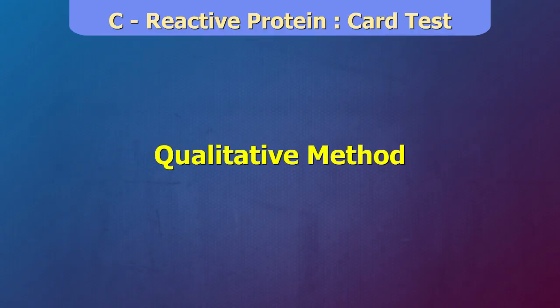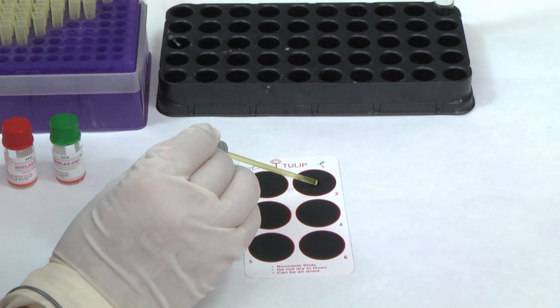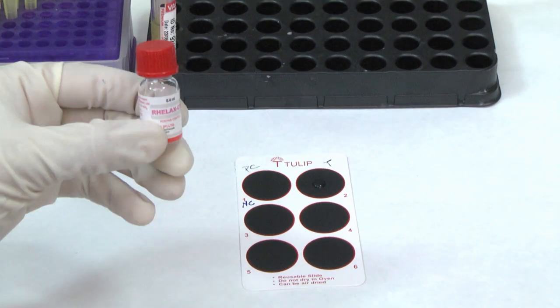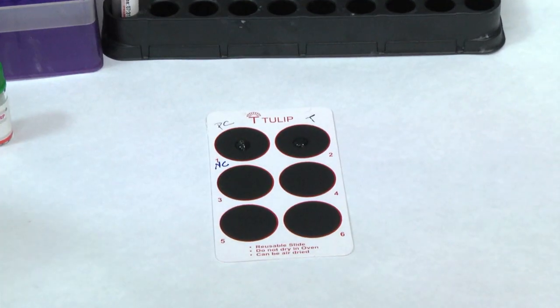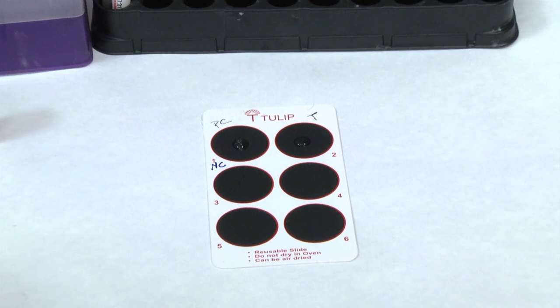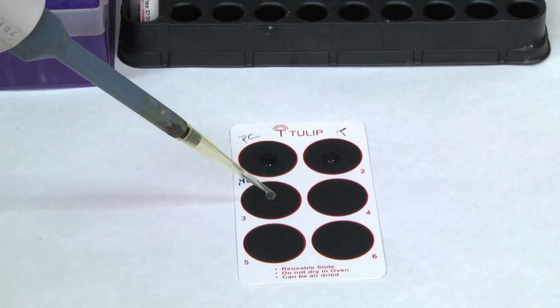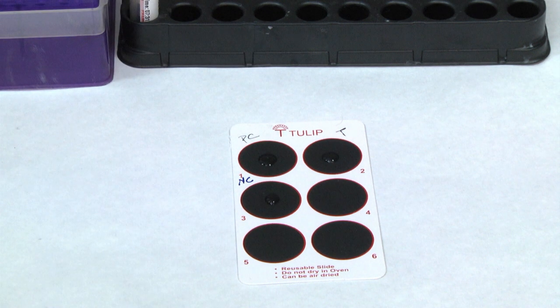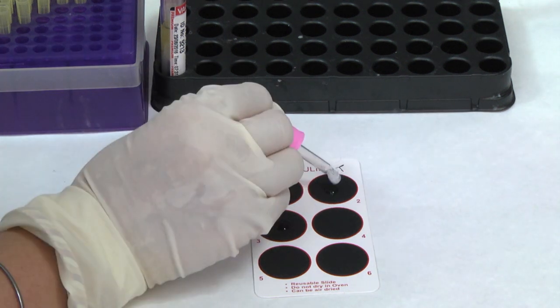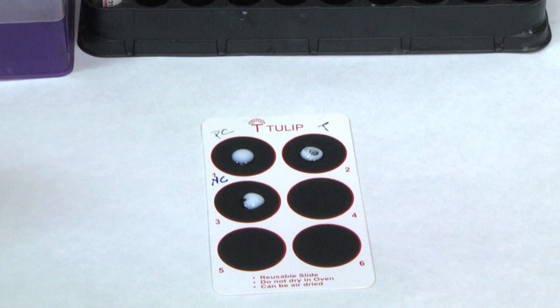Qualitative method: place 1 drop of undiluted test sample on field 2. Place 1 drop or approximately 40 microliters of CRP positive control on field 1 of the reaction slide. Place 1 drop of the CRP negative control on to field 3. Add 1 drop of CRP latex reagent to all the fields. Do not let the dropper tip touch the liquid on the slide.